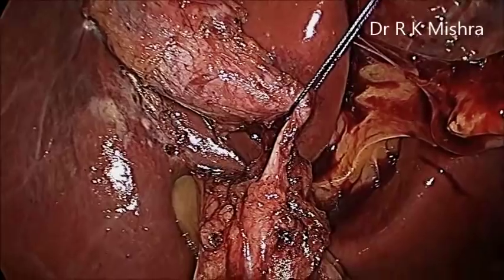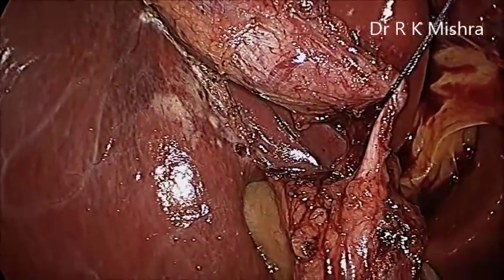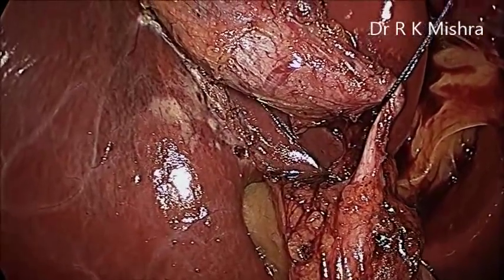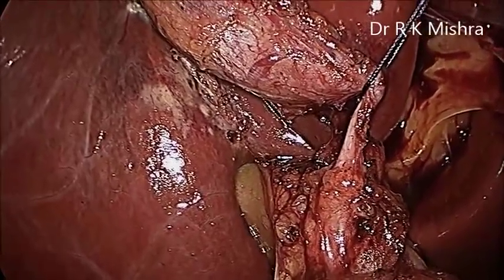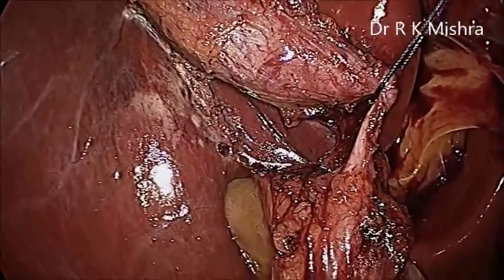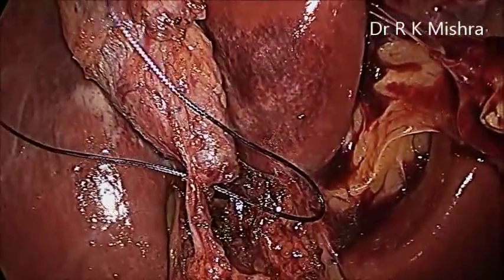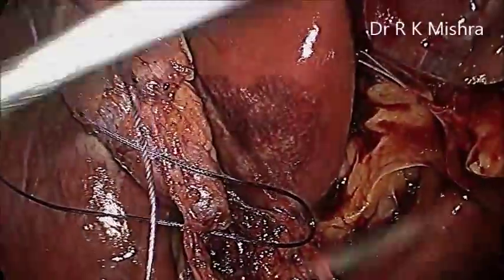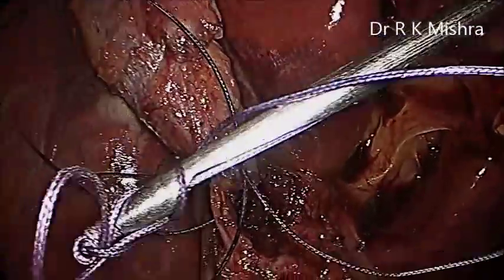Now configuration is Melger's knot is 2-1-1, Mishra knot is 1-1-1, and with the third 2-1 and again third. So these are the configurations of the extracorporeal knot which you can tie, and you have to slip it once with the finger, and now it is ready. Here this is the knot pusher coming, and slowly you can make it smaller.